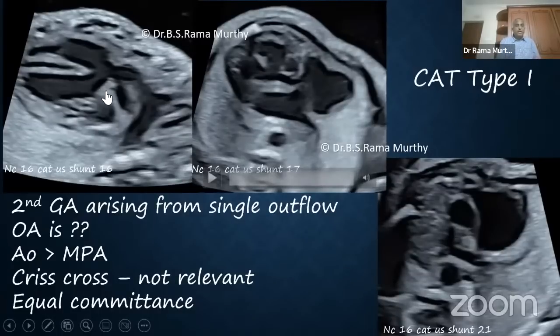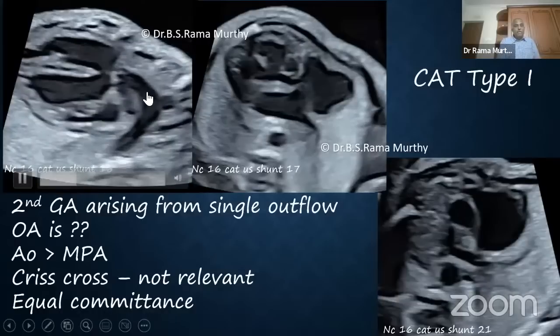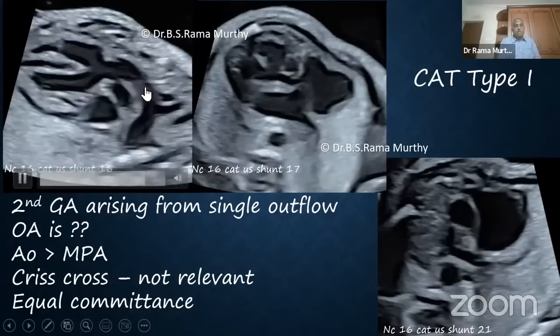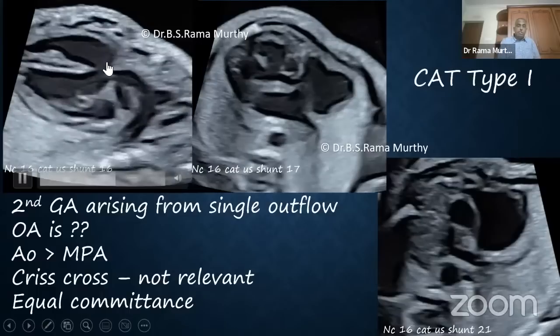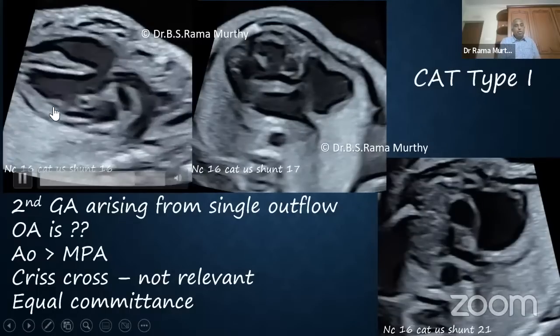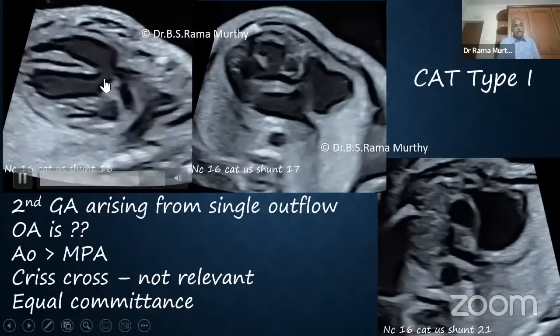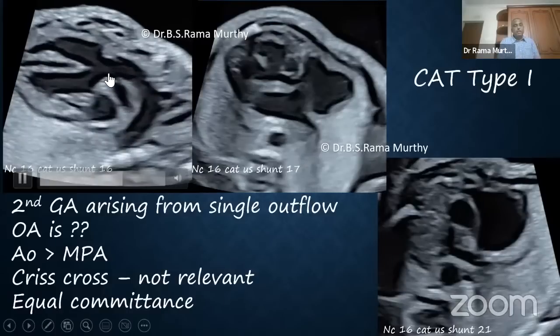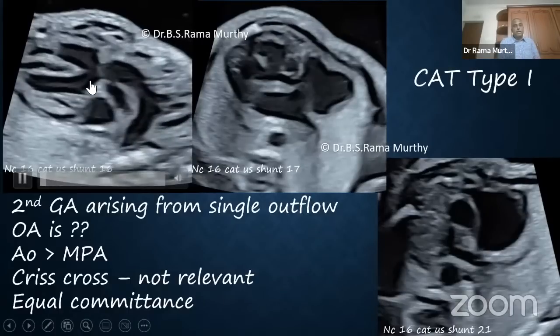Now let's look at this particular case and answer the first question. First of all, is there an overriding artery? Yes, there is an overriding artery, which is really big. Just like in the previous case, this also is huge, and in fact, it is much, much bigger than the previous case, very markedly big, right? And it is overriding the crest of the interventricular septum, almost equally committed to both chambers, right?